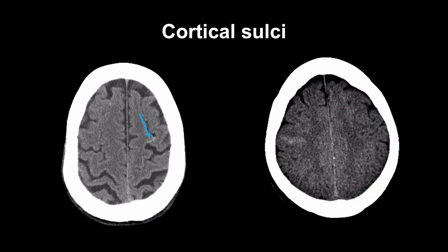The CT scan on your right is from another patient with a small subarachnoid hemorrhage. Notice that the asymmetric high attenuation in this case is less sharply defined compared with the case we just saw. The conspicuity of the hemorrhage is dependent on the quality of the CT, the technique used to create the CT images, and the slice thickness. Hemorrhage is usually more apparent on reconstructions of 1-2 mm.